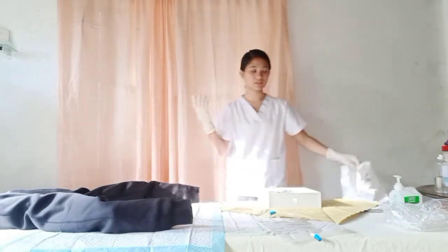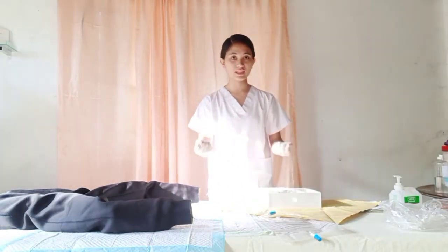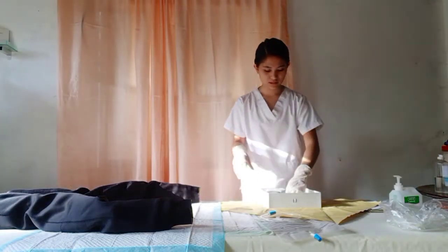Discard the wrapper. Now that I am wearing the sterile gloves, I can have access to the equipment inside the kit.